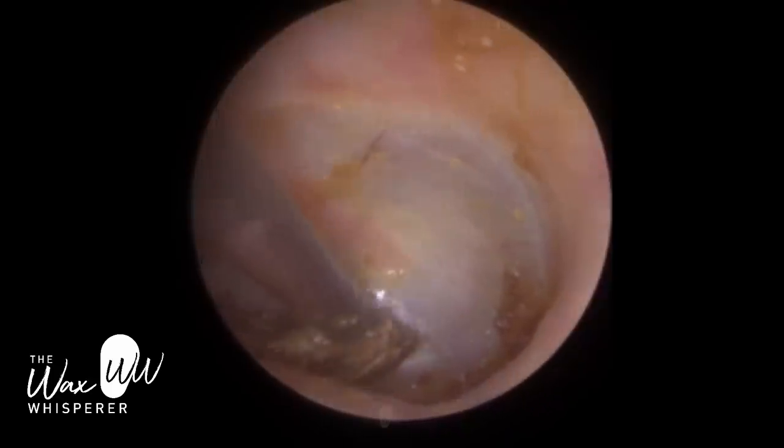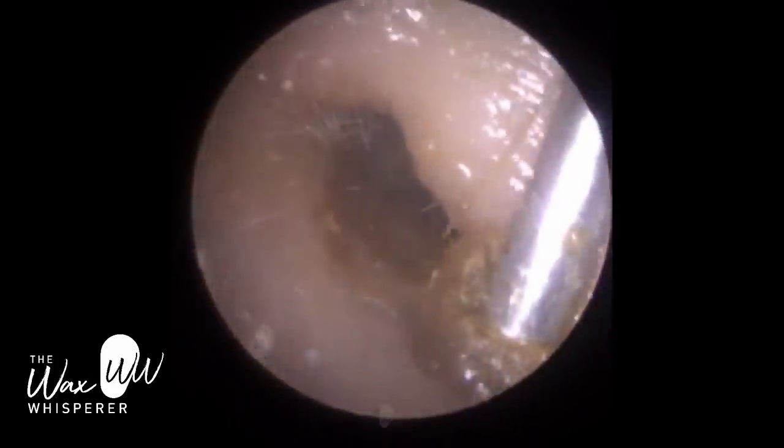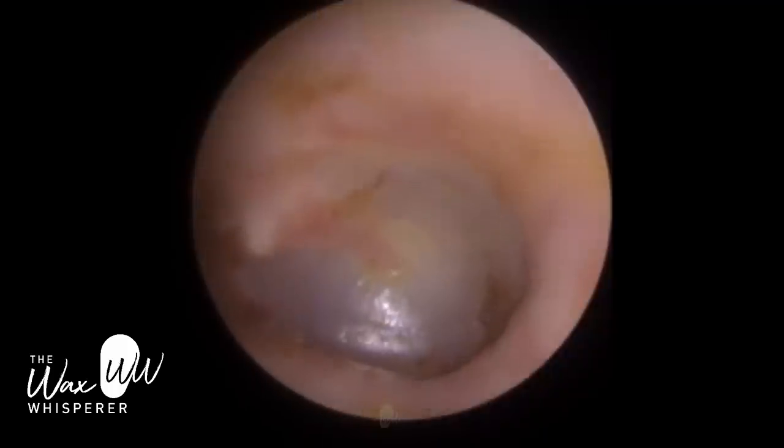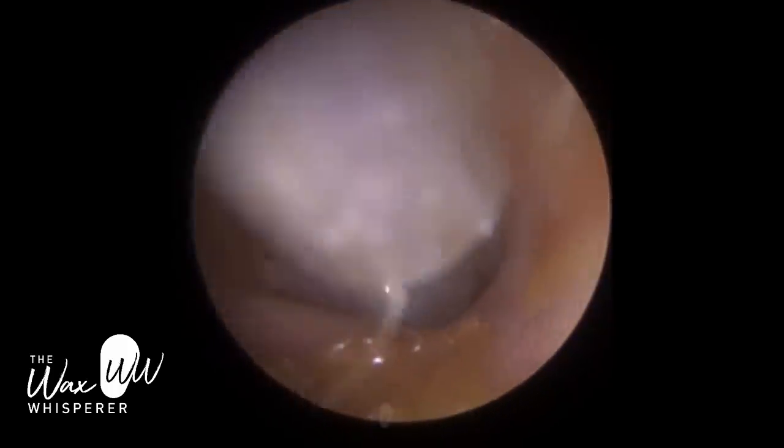Whenever you work near the eardrum, you do have to have a steady hand. The thickness of the eardrum is approximately 0.1 mm — very, very thin and very delicate. I'm happy with that result.